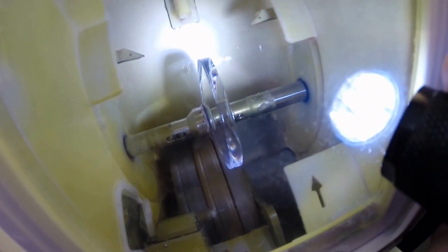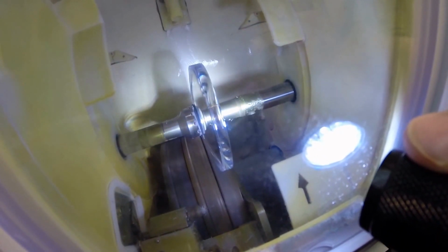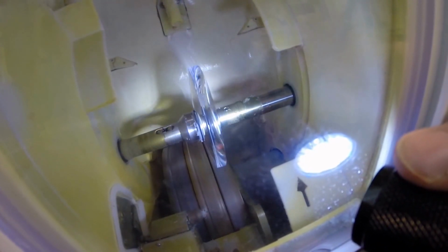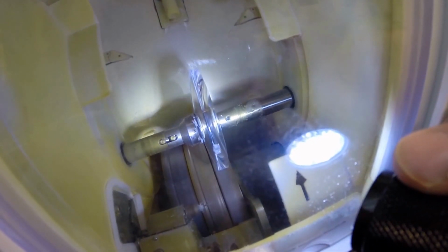Now if you see light flickering in the background, that is water running. It's only there to catch the optical sawdust. Polycarbonate lenses cut dry, where plastic and high index plastic cut wet. Now in the last bit of the cutting cycle, water will spray onto the lens just to wash it, but it'll cut dry until then.